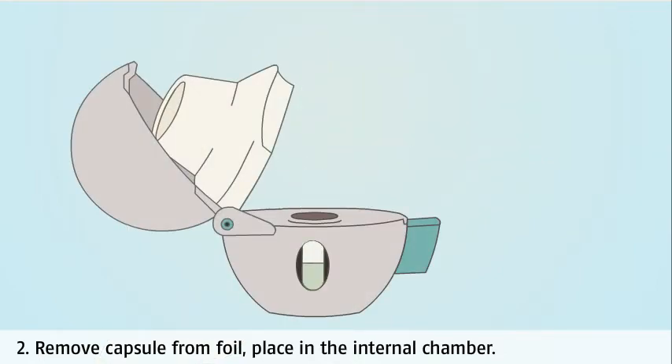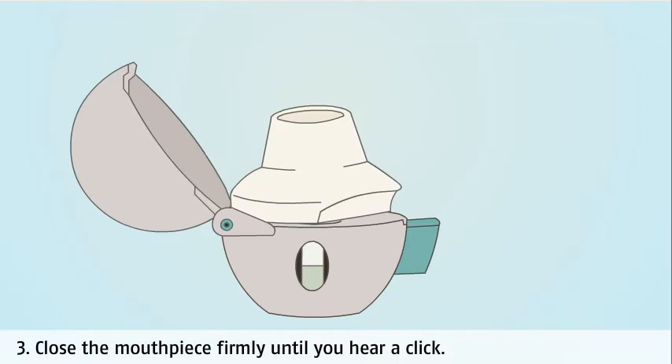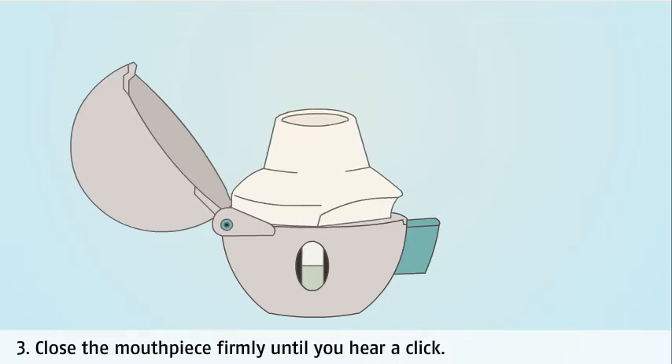You should only remove the capsule from its sealed foil immediately before use. Close the mouthpiece firmly until you hear a click — this secures the capsule. The capsule will be visible through the clear window at the front of the inhaler.